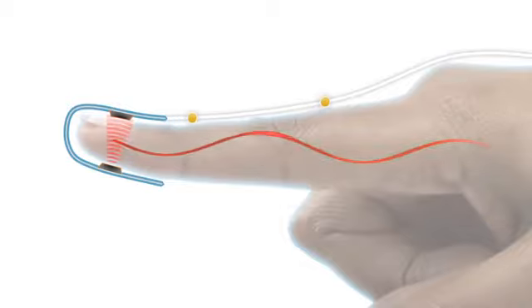Nonin sensors have an emitter that projects a tuned light wave pattern through the arterial blood, and a detector which receives that light. Changes in the light wave spectrum during pulsation of blood generate a measure of blood oxygenation and pulse rate sent to the pulse oximeter.